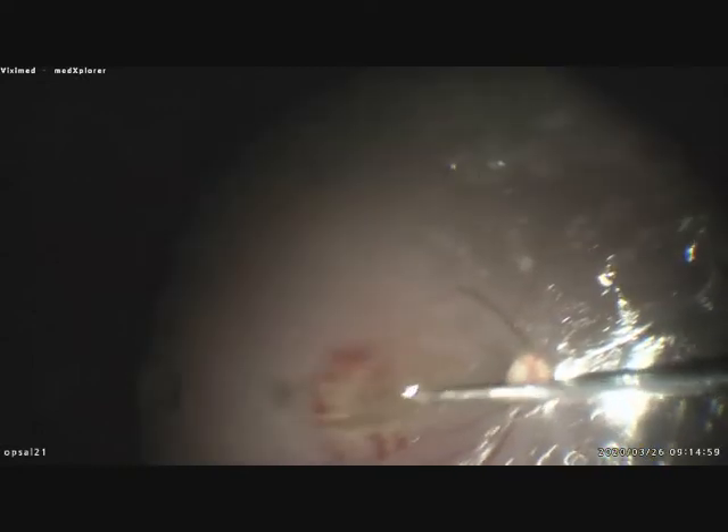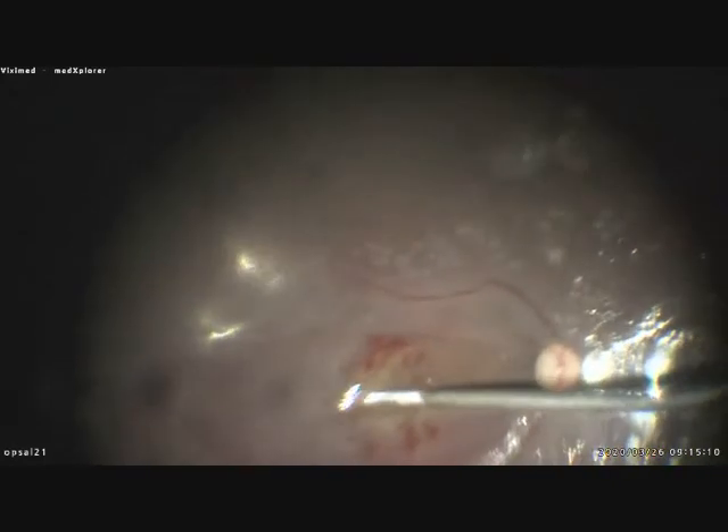You can see there are even small hemorrhages on the retina from the massage. I think this massage manoeuvre loosens the retina from the underlying tissue and allows it to re-adapt and close the macular hole. It is important to use a silicone tip vacuum cleaner for this manoeuvre.